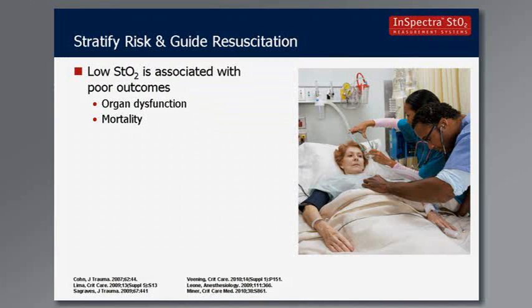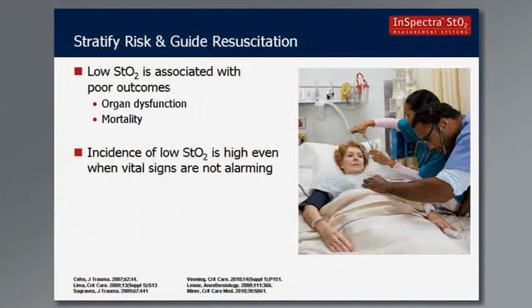As previously noted, studies have shown that low StO2 is associated with poor outcomes such as organ failure and higher mortality rates. This means StO2 can be readily used to help identify patients who are at risk of bad outcomes. Now, recent clinical studies in critically ill patients found that low StO2 occurs frequently. Ardolic and colleagues demonstrated that 20% of treated emergency department patients waiting to be admitted to a medical floor had StO2 readings less than 75%.